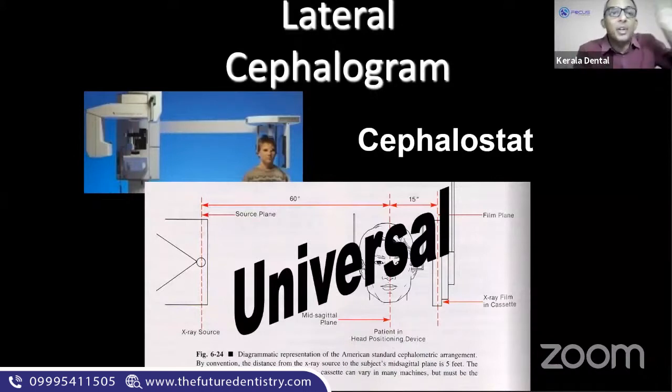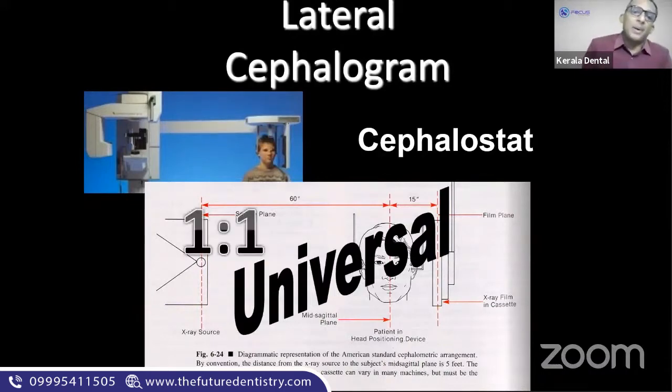An X-ray taken at New York University at this point of time. Why I said New York University is because I was trained at New York University. So the X-ray taken at New York University and in Aluva, where I'm working at this point of time, if you do a lateral ceph tracing, the angulations will be exactly the same, because everywhere in the world, it follows this philosophy. So look at that distance, note it down. All that will be clearly covered in the coming sessions, big sessions on all this. Do not worry. These are orientation programs going on.